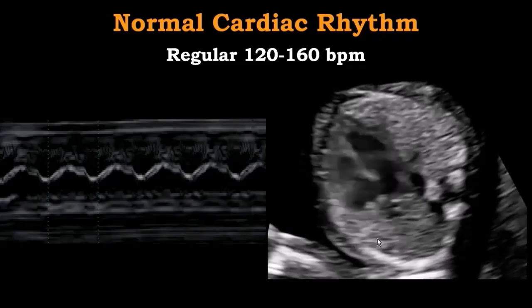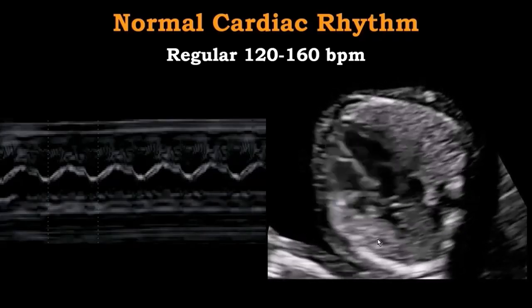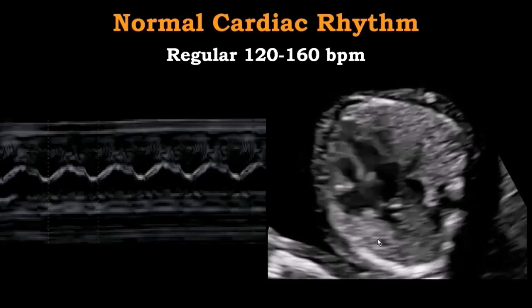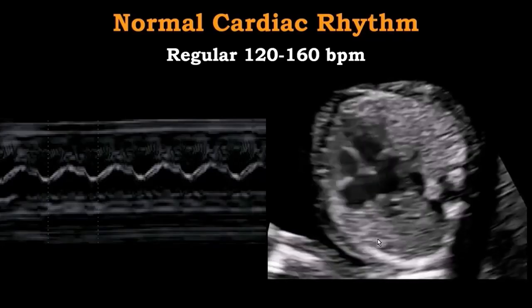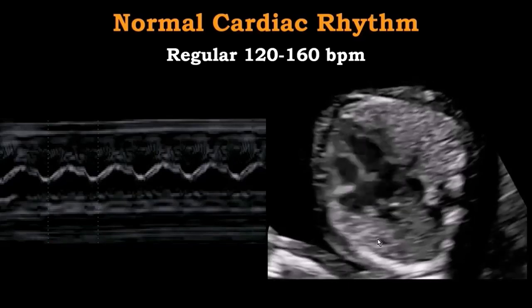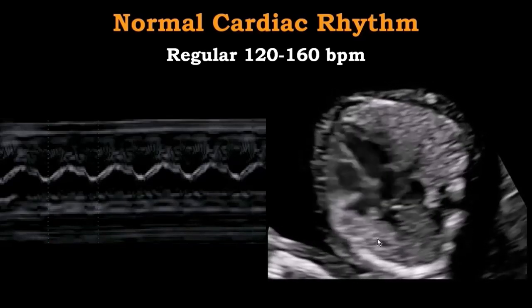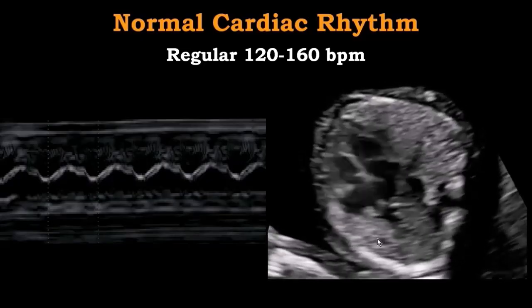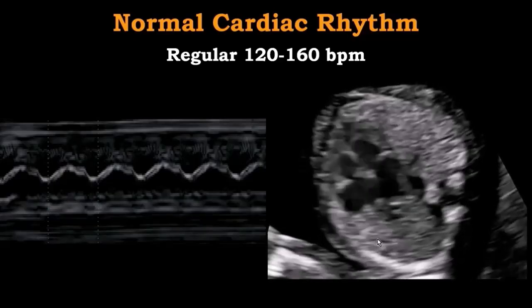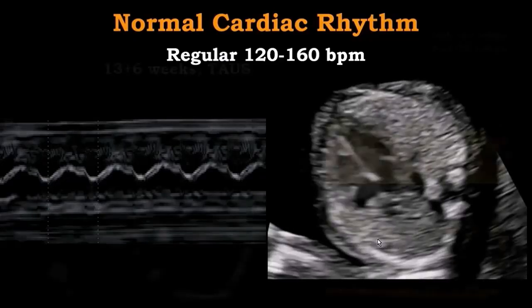What's really important for the technical component of getting this is that the national guidelines require utilizing M-mode as the primary method to look at the cardiac rhythm. This is important to keep in mind, in particular, because it matters in terms of the safety aspects, and we will talk about them in a minute.